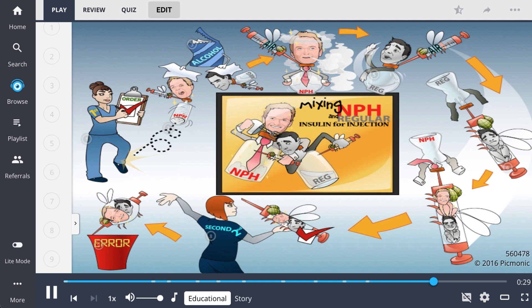First, verify the order. Next, gently roll the NPH between your hands. Be sure to apply alcohol to multi-use vials before use.